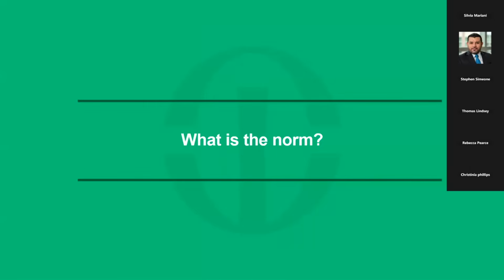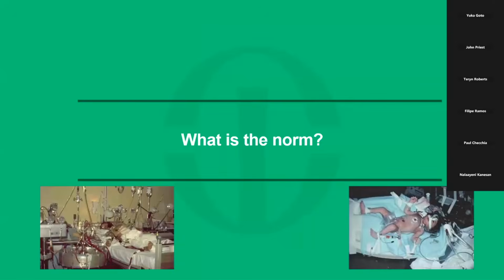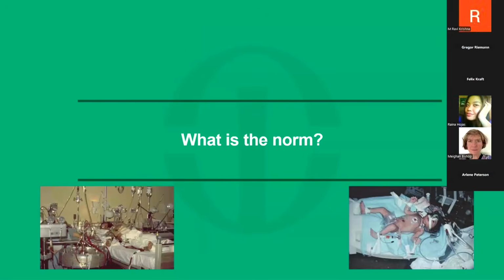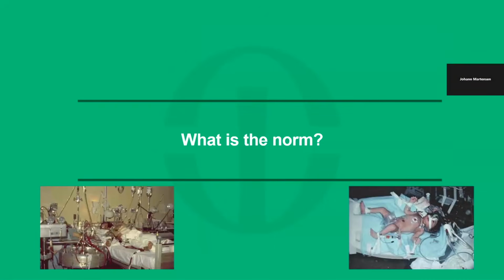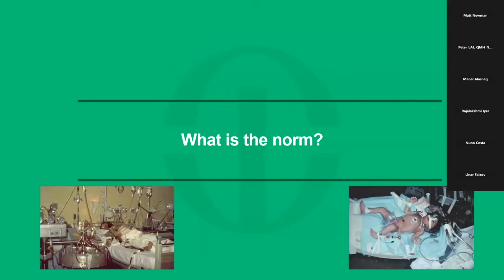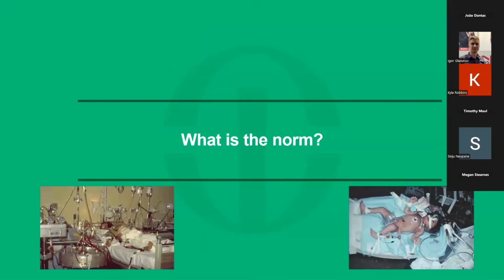All right, so what is the norm exactly? We know that ECMO has been around since the early 1970s for adults as well as the pediatric and neonatal population. Thankfully, we don't have these oxygenators anymore. Our beloved Dr. Bartlett was responsible for Esperanza on the right, but these oxygenators are no more.